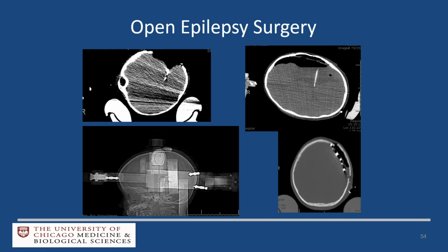That brings us to the next topic, epilepsy surgery. So again, almost like tumors, resection control, in this case, not of a tumor, but resection control of an epileptic focus or of a disconnection. You can see these are actually both children. One is a functional hemispherectomy, and the other one is a posterior disconnection.